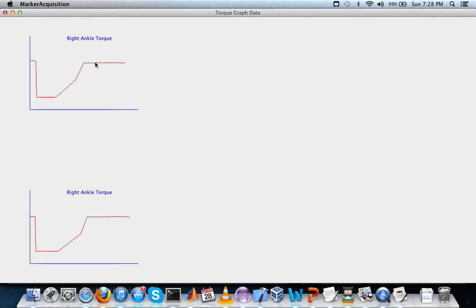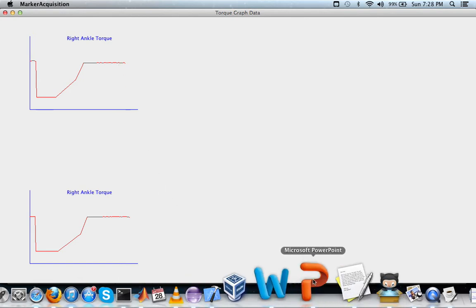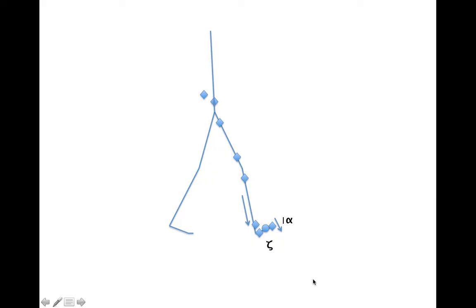And then again, the next flat bar is when the leg is swinging through the air, and again, there isn't really much torque there. But these calculations have to be made much more accurate, and that's the first thing I'll be doing over the next week. After that, I will be working on recalculating the force, and this is actually a lot more difficult than calculating the torque. The torque was essentially a simple I alpha relationship.